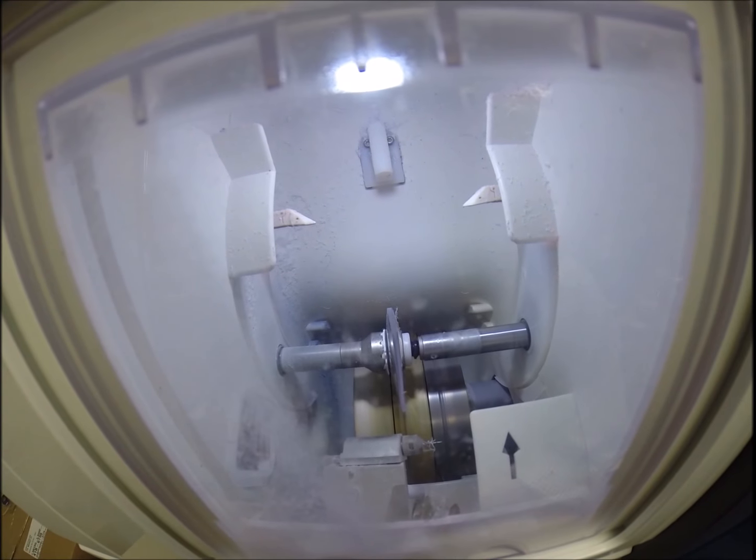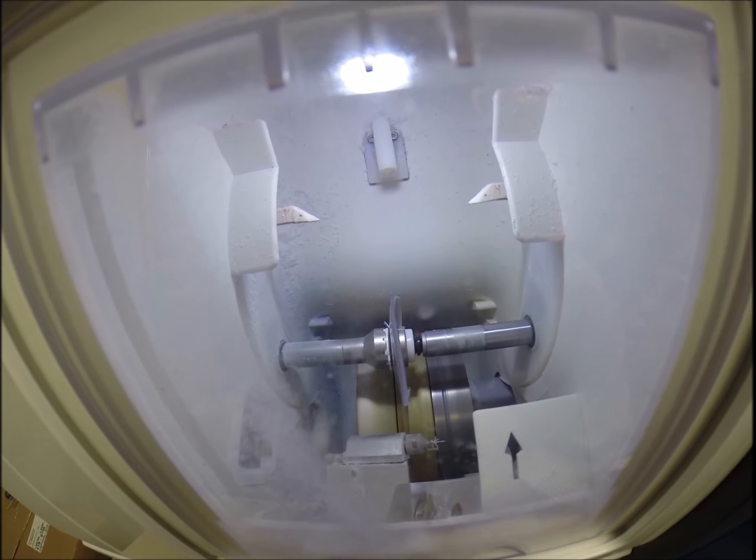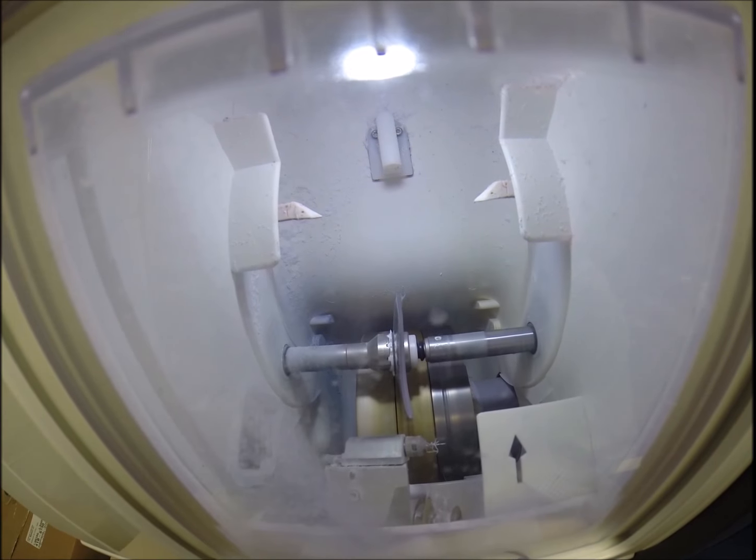So if you notice, your lens a moment ago was completely flat, just like a nickel. I could take it out and it would stand up on the counter. Now it's getting the V-shaped bevel to stay inside the bevel of the frame.